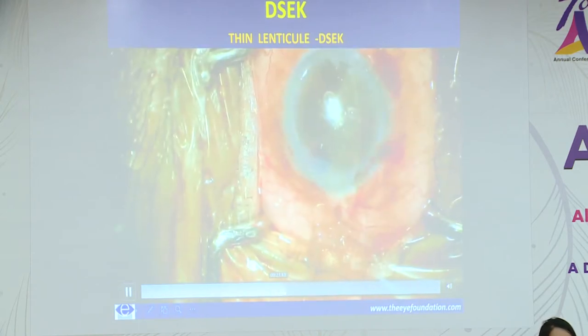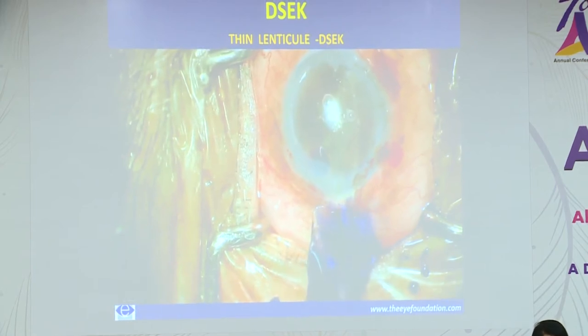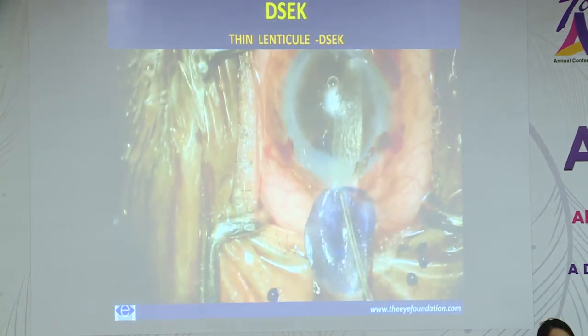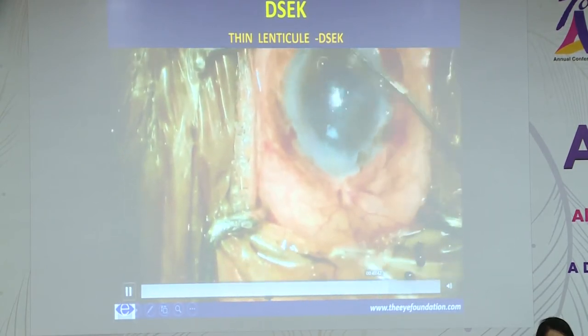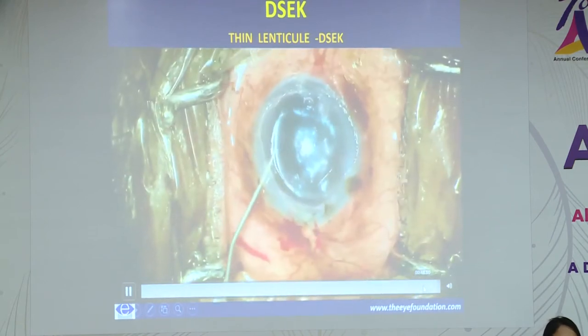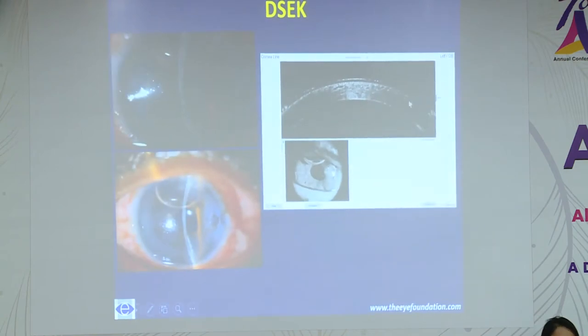I usually stain these thin lenticules with trypan blue, so that identifying these lenticules in the anterior chamber will be easy, and manipulation in the anterior chamber becomes easy. This is the OCT picture of the same patient, and the thickness of the lenticule here is minimal. It is maybe less than 100 microns.